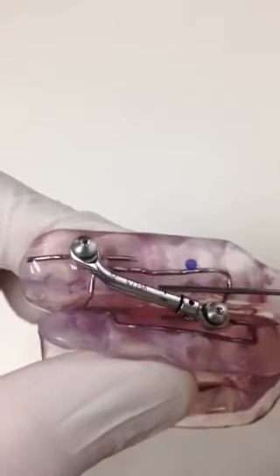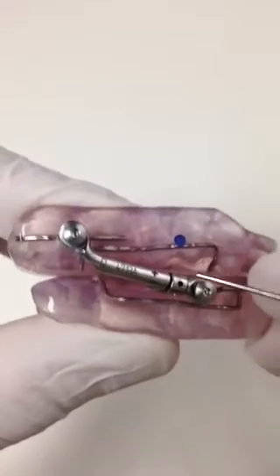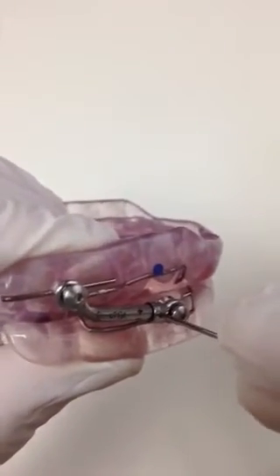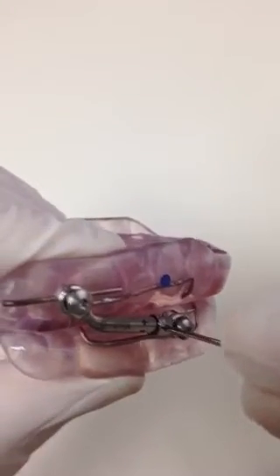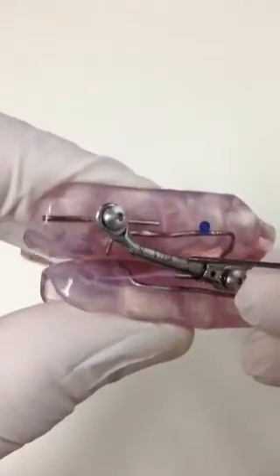On each arm you can see there's a minus and a plus arrow. When adjusting the appliance, you'll just place the keyhole into the pin at a 90 degree angle. If you want to adjust the appliance outward, you turn the key towards the plus — so you go from the minus to the plus.